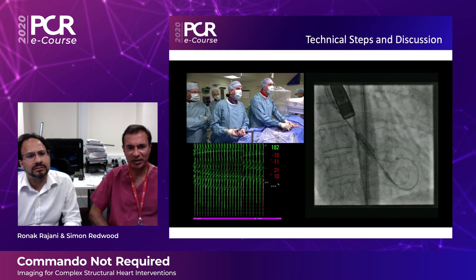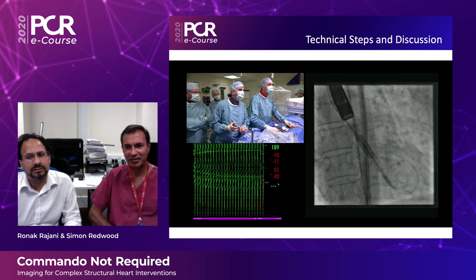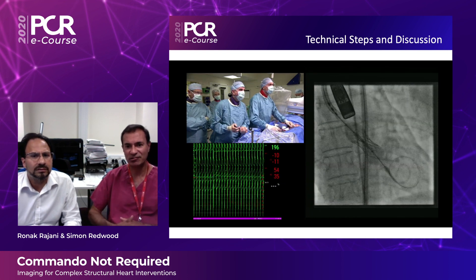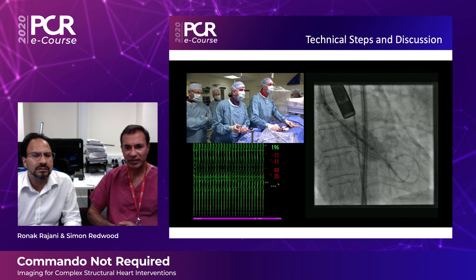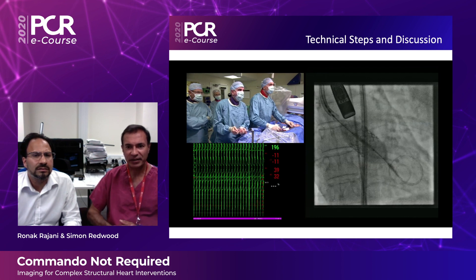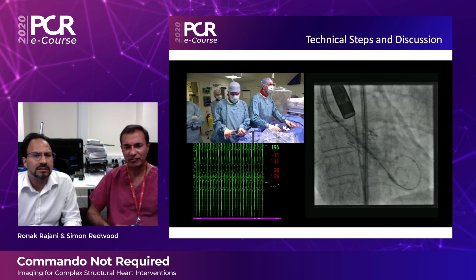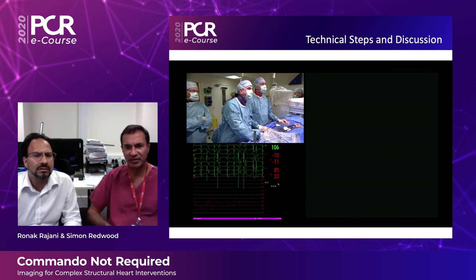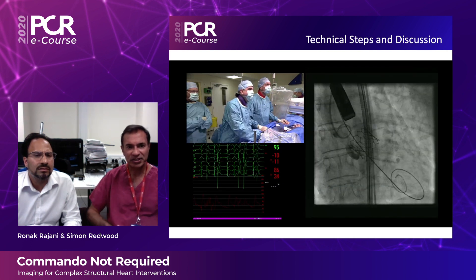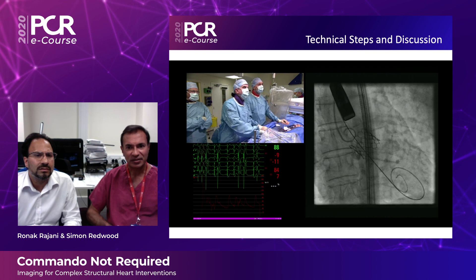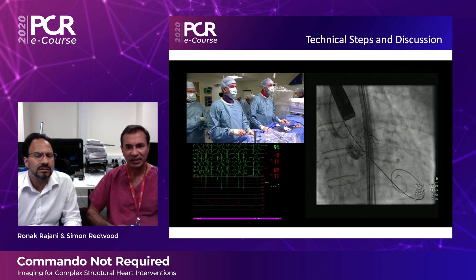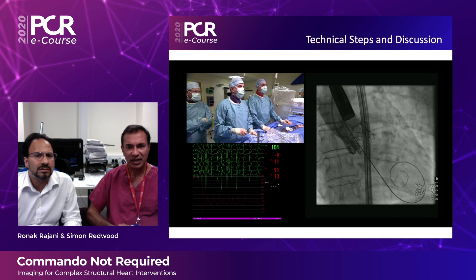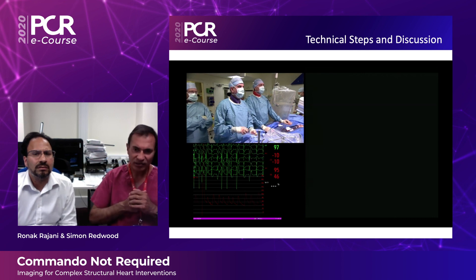It actually turned out to be quite a complicated procedure overall, but to begin with we started with a straightforward TAVI that was very easy and quick — a 23mm Sapien III ultra valve, which you can see being deployed there with the safari wire in the left ventricle. There was no significant regurgitation after deploying that at nominal volume, and we then moved on to treating the mitral valve.